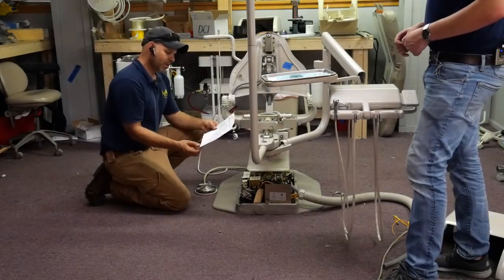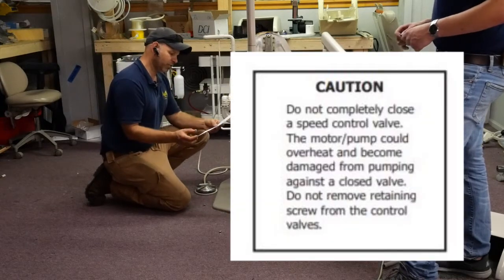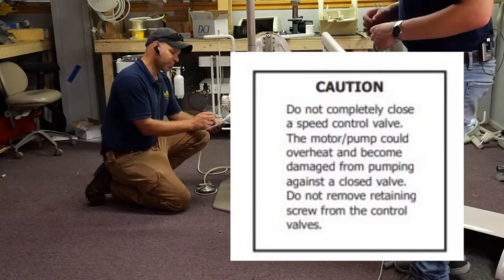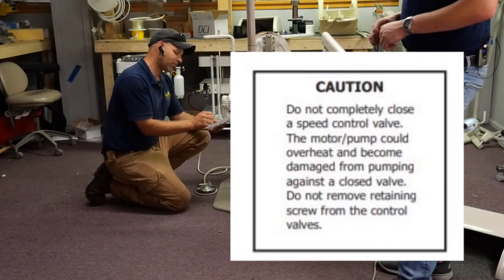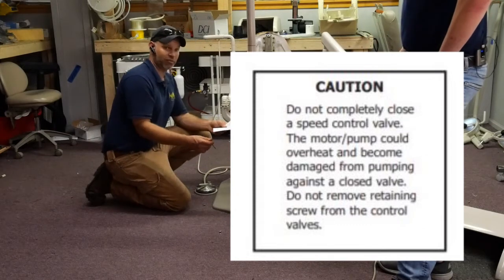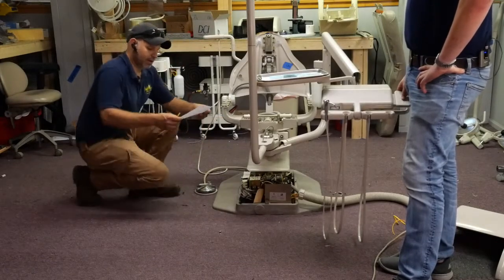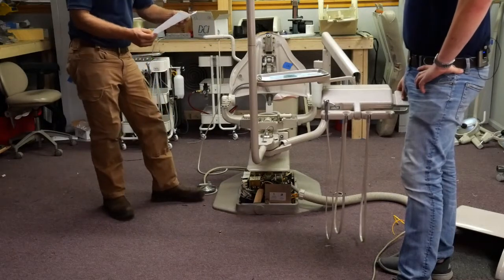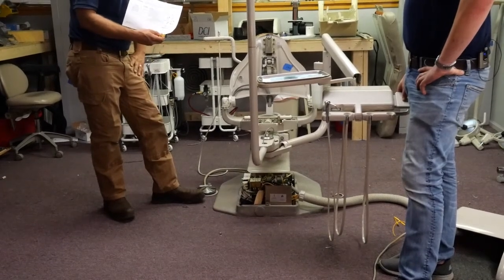The paper here that I was able to print, and again I'll put this on the screen for you, says: caution, do not completely close a speed control valve. The motor pump could overheat and become damaged from pumping against a closed valve. And do not remove the retaining screw from the control valve. The reason for that is, if that screw is completely removed, it will spray oil everywhere. The link to this instruction, I'll go ahead and put in the notes of the video.